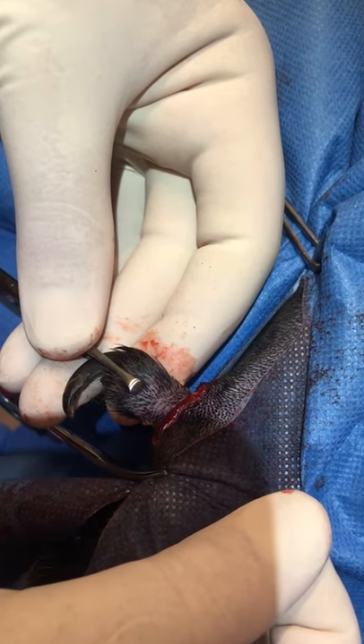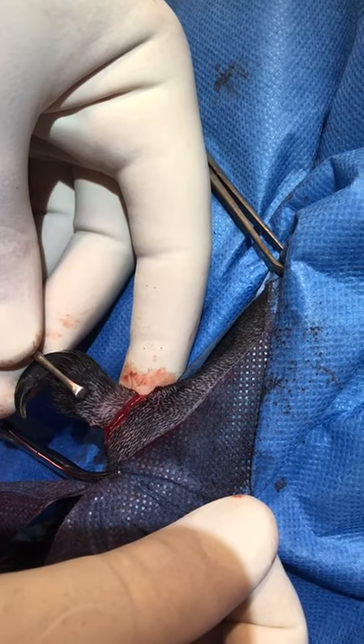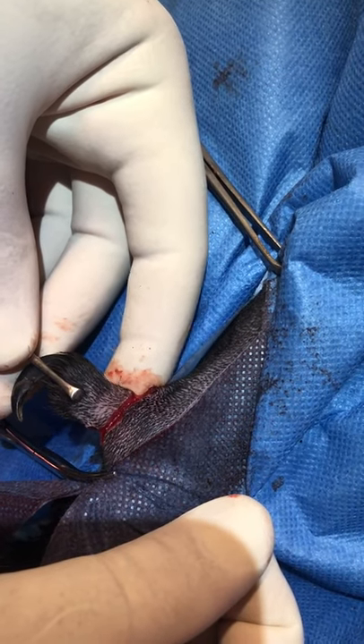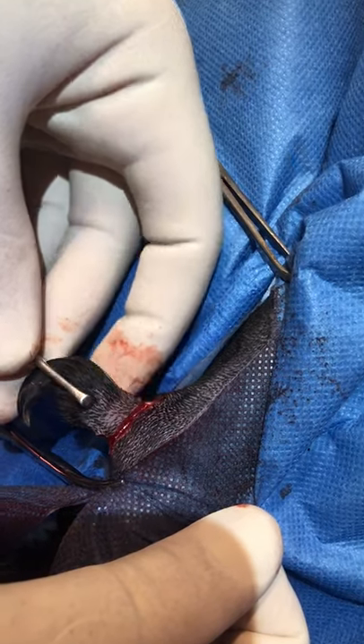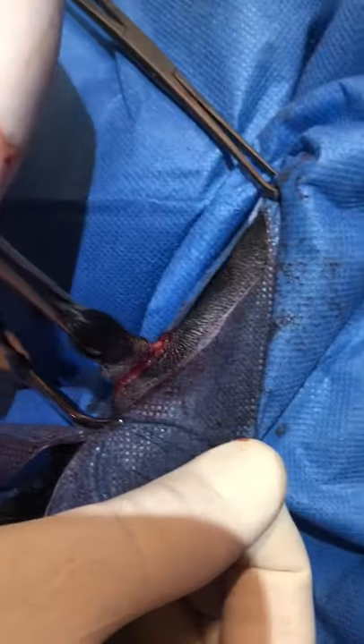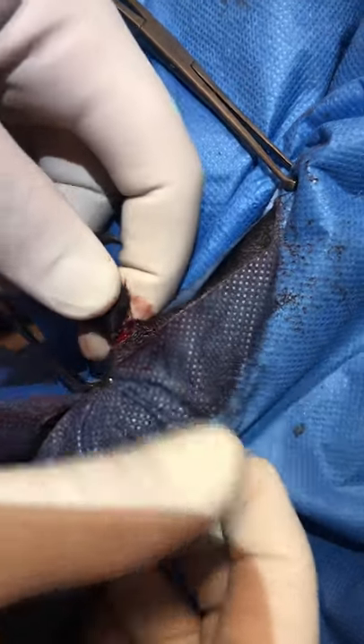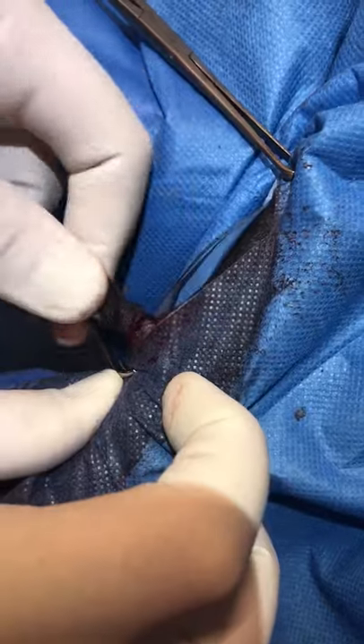This is a hind leg dewclaw — it's got no bone in the subcutaneous tissue, it's just a loose, floppy dewclaw. What I've done is cut through just the skin all the way around. Then with an instrument on the dewclaw, we just twist that pedicle — this is quite a wide one.